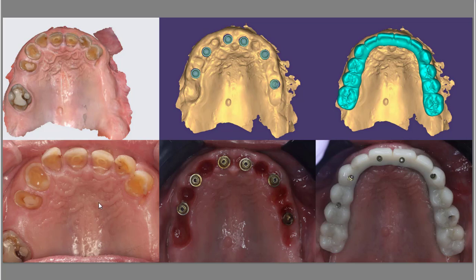You can see this is the initial presentation, this is after the patient has healed, and this is the final result — a bar-supported PMMA full arch.